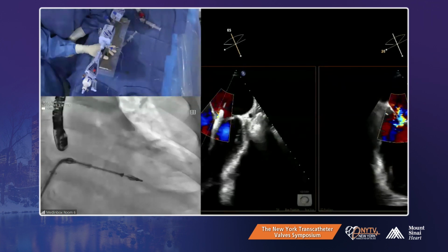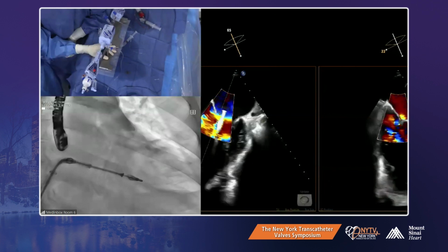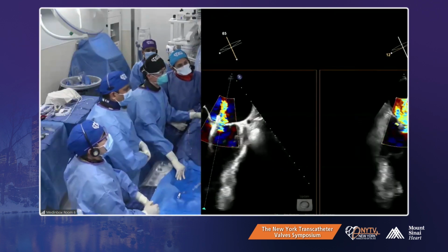Can you put the color there? Oh, lateral. So to me, the jet looks more lateral. Yeah, interesting, right? But you'll put a second clip anyway. Yeah, but you need a second.